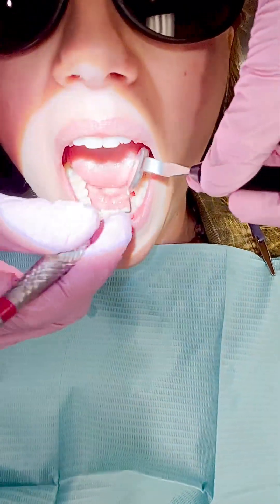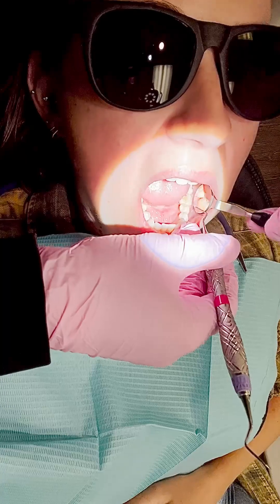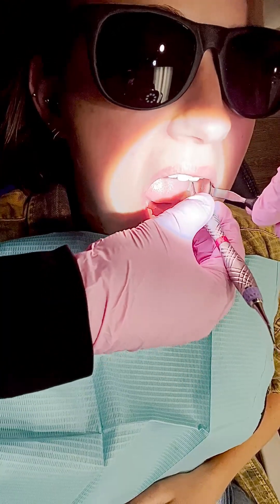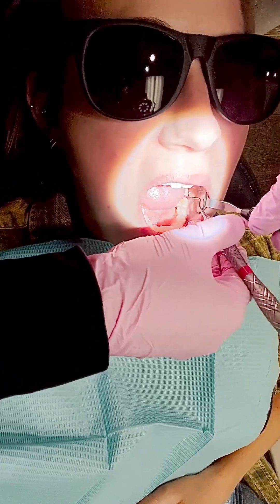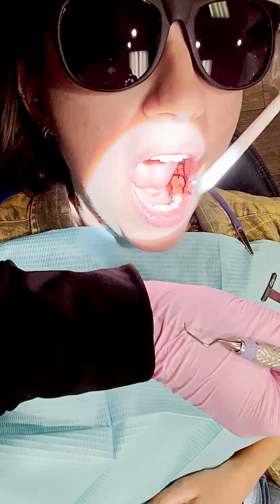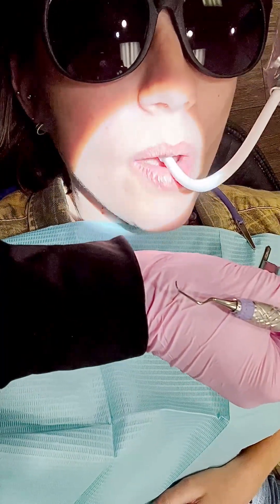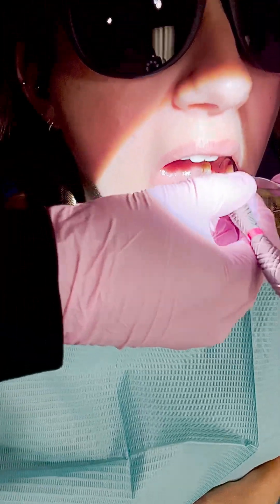Now I'm going back in with my extended sickle — the pink band. This is really good for the lower anterior buccals. I like the curette for the linguals and the sickle for the buccals. The tissue's a little bit tighter on the buccals than the linguals, so the sickle gets interproximal a lot better. She's bleeding, so I'm suctioning the blood so I can continue to work and see the area — especially for the video, I'm trying to keep it dry.